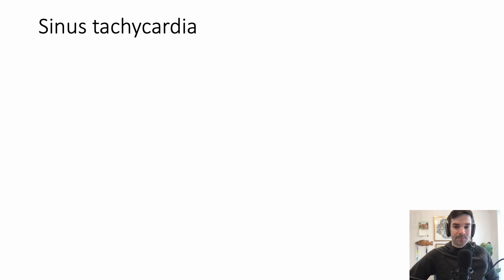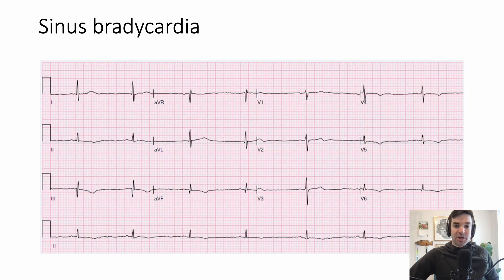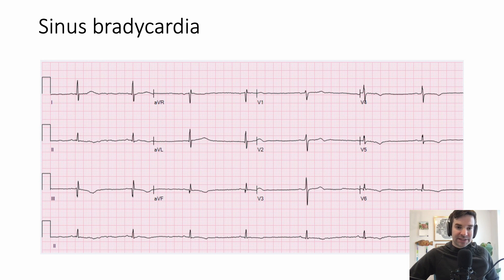Let's show an example of each. First up, sinus tachycardia. We can see there are a lot of QRS segments here — count them all up and multiply by six, and you'll realize it's well over 100 beats per minute. We can also see a P wave before each QRS, so this represents sinus tachycardia. You can contrast that with sinus bradycardia — right away you can see there are way fewer QRS intervals. Counting seven QRS complexes times six gives a heart rate of 42. The P waves are a little hard to find, but with the eye of faith, you can find them before each QRS.